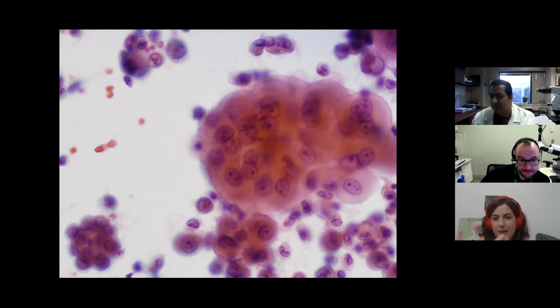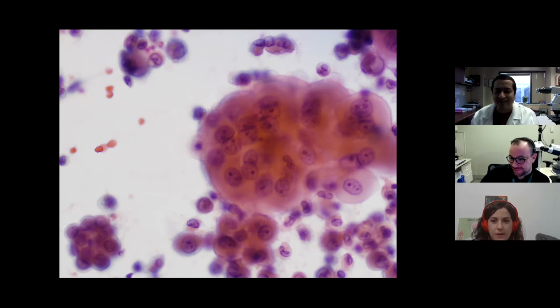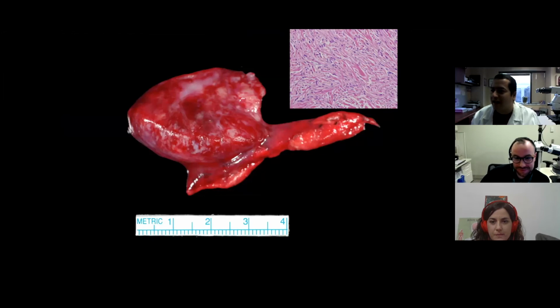But here, I see cytology is a bit different. Yes. No, okay, this is definitely not a spotter. The thing that expert cytopathologists can't comment on is definitely not a spotter, so apologize for that. Okay, this one is a spotter, so bear with me here.